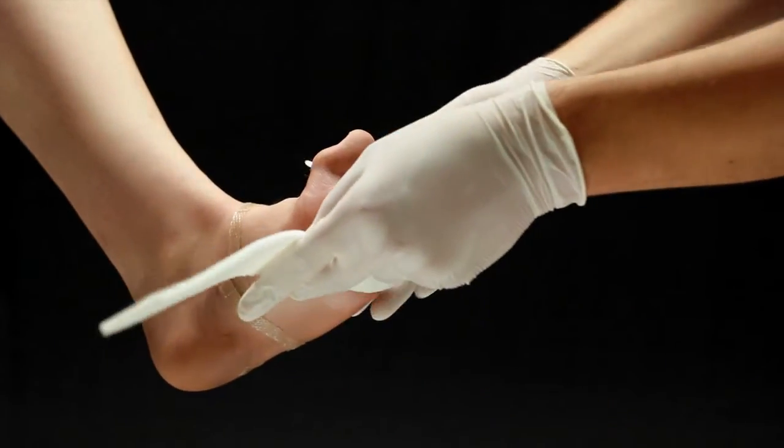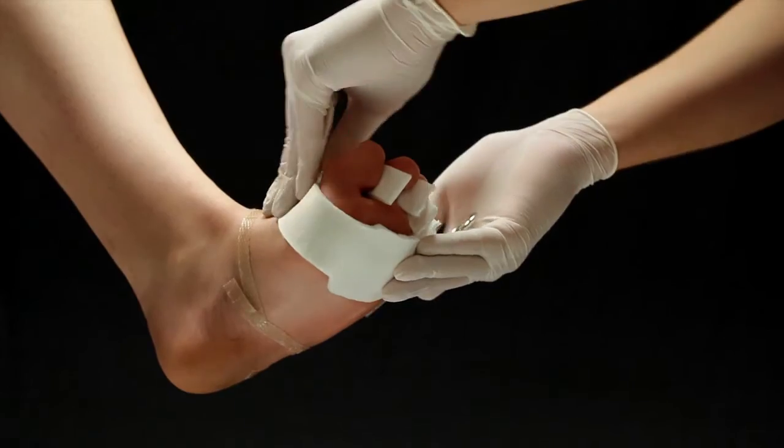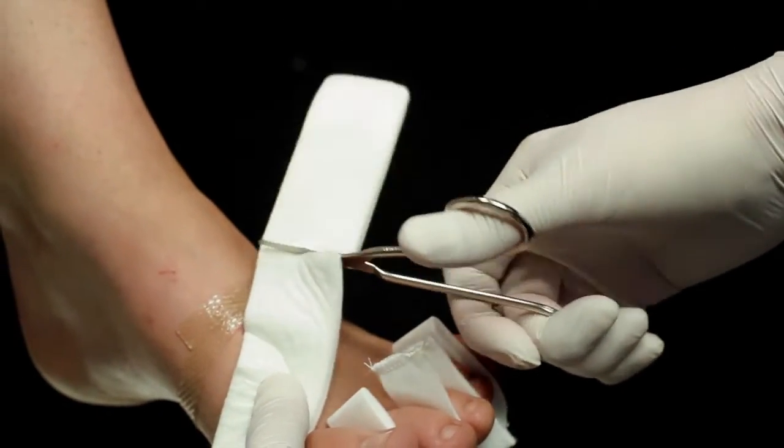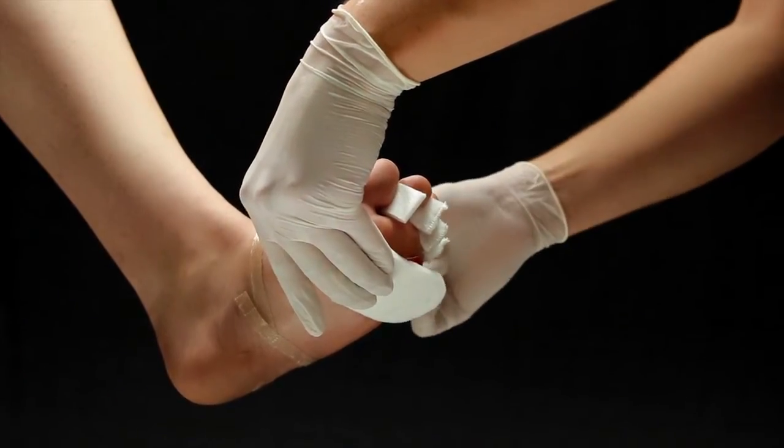Place the circular portion of the dressing on the wound. Wrap the rectangular piece around to the top of the foot and trim the excess. For wounds between the toes, only the long rectangular piece of the dressing may be needed.